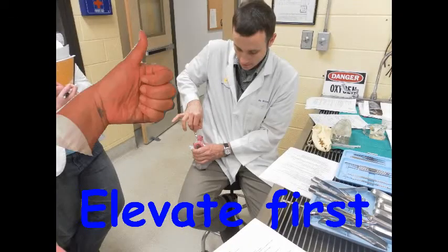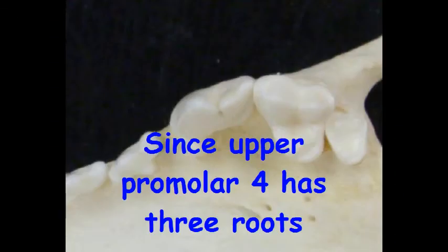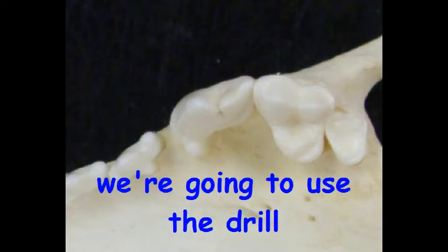Well, thank you, Mr. T! Okay, we get it. Elevate first, not pull. Since Upper Premolar 4 has three roots, we're going to use the drill. So that means more tools!